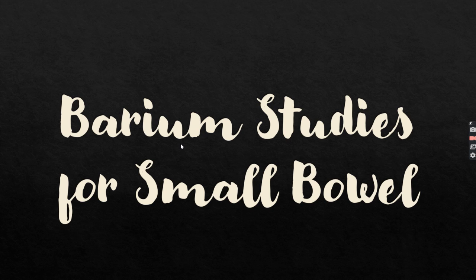So these were the basic points regarding the barium meal after barium swallow. Now the third very important component, barium studies for the small bowel. We have demonstrated any pathology in any patient in the oral cavity, the pharynx or the esophagus, then the stomach and the duodenum we have covered. Now let's come to the small bowel. The small bowel has three parts: duodenum, jejunum, and ileum. Slightly overlapping sort of thing.